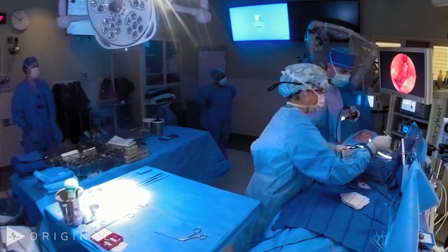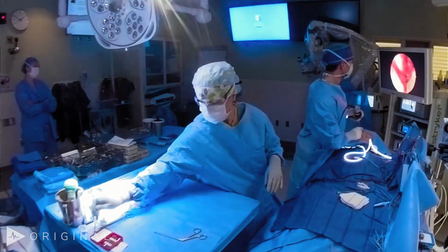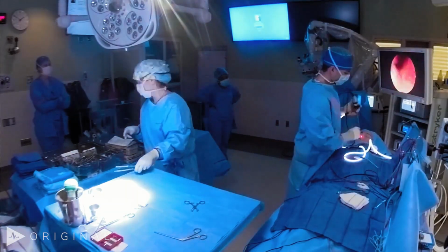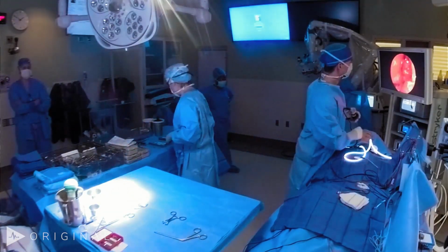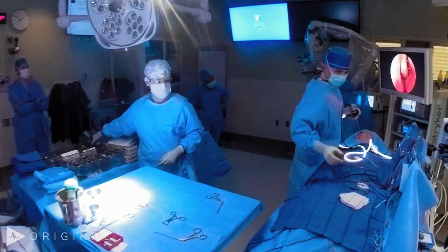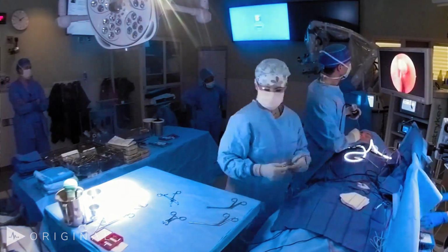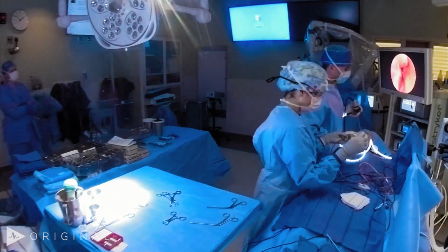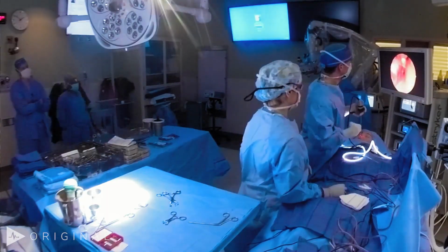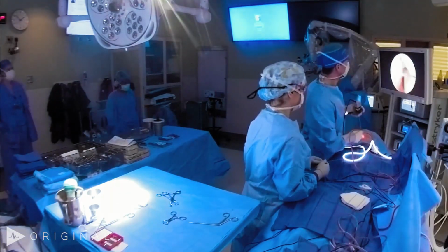We ensure that the nasopharynx is still clear so the patient has an adequate nasal airway. We then gently medialize the middle turbinate so that it does not scar off the maxillary sinus. And we again place gel foam in the middle meatus to ensure that the middle turbinate does not lateralize. We also place gel foam between any areas of exposed bone and mucosa so that the patient does not get a synechia or a scar band. And then finally, the nasopharynx is suctioned clear of blood and irrigation. We always check on the opposite side. Suction the nose clear. And that completes the procedure.